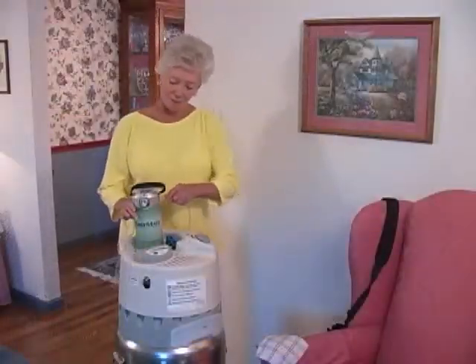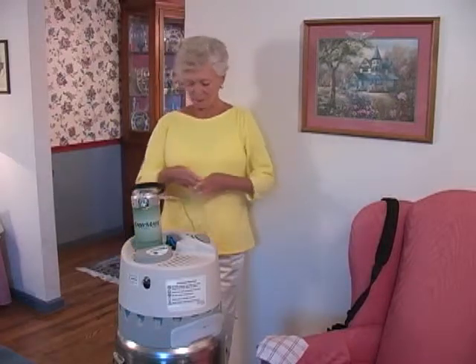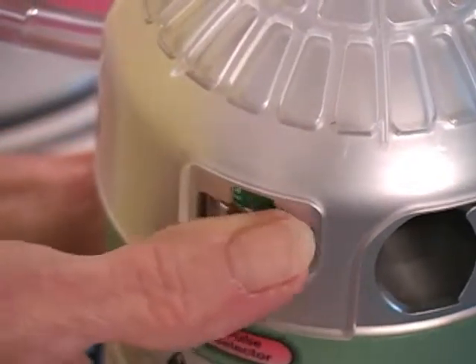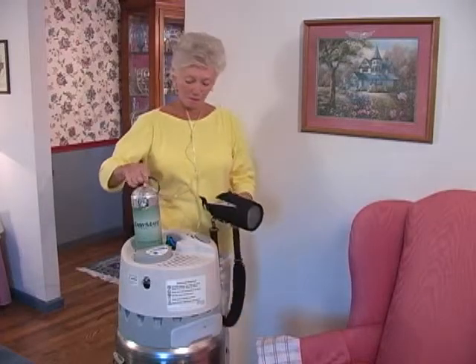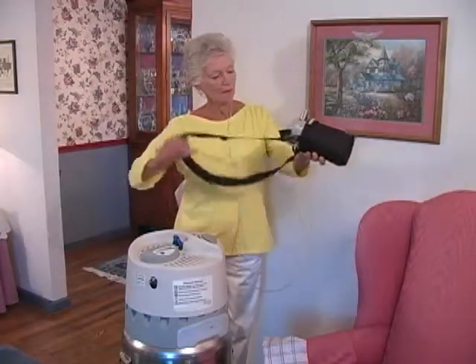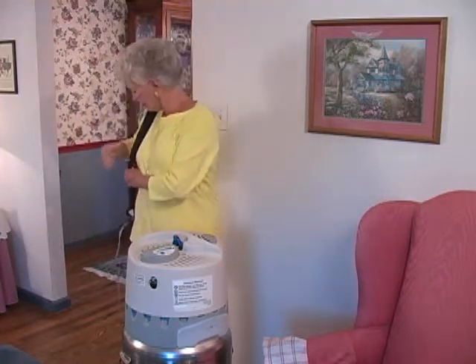Attach the cannula to the outlet on the EasyMate. Insert the cannula's nares in your nostrils and fit the tubing comfortably over your ears. Then set the pulse selector to your prescribed liter flow and slip your EasyMate into the carrying bag if you like. Remember, it's normal to hear a hissing sound from the portable unit's relief valve.